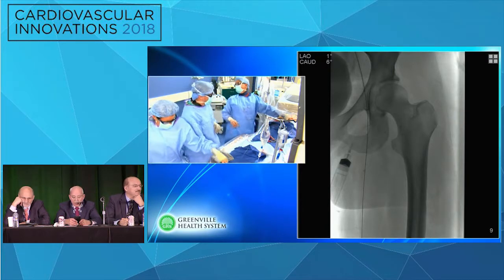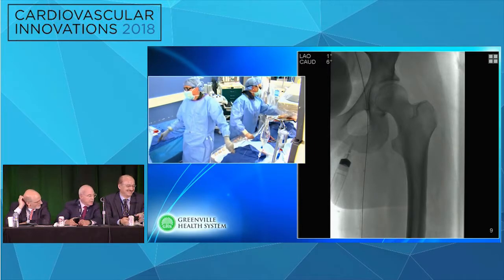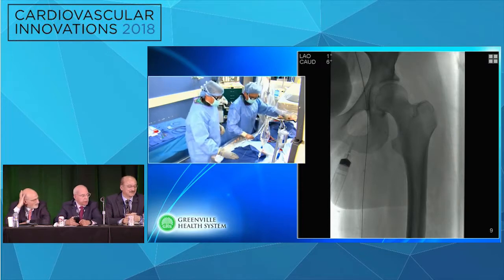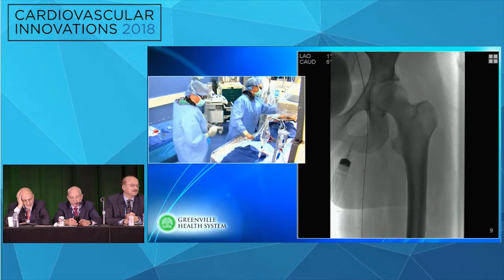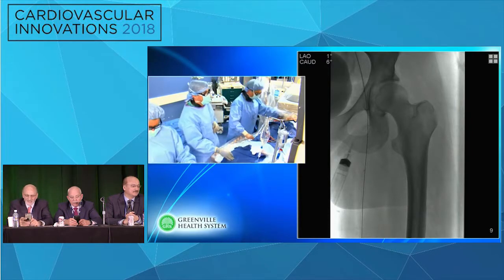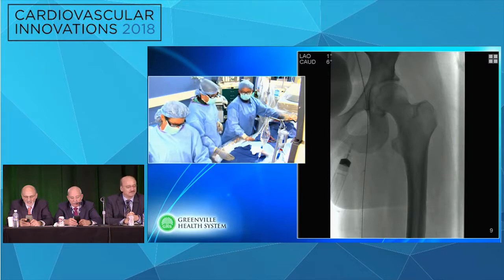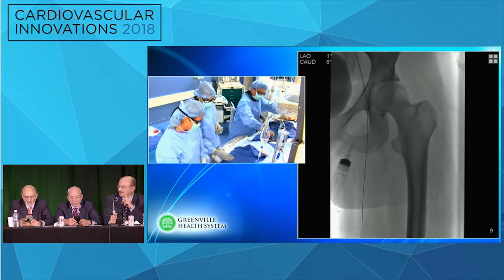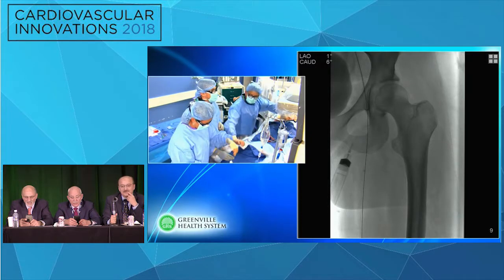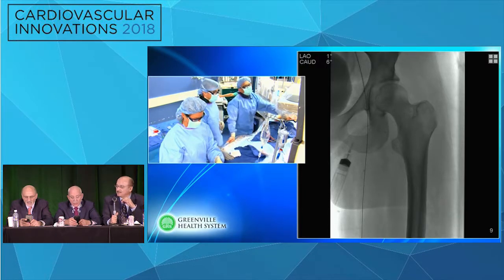Endarterectomy? I don't think there is a good solution for this because, as Kenny mentioned, I think putting a stent across that ligament into the femoral vein is going to be problematic. So I think it would be nice not to do that. I was just thinking, can you put a big DCB there, a drug-coated balloon? There is no wall. And we use it for fistulas. So if we can use it for fistulas, I think it may be helpful to prevent restenosis in that area. I know it's clots, but it's probably some of it is also hyperplasia and inflammation. Bruce, 8 minutes. Sorry. All right.